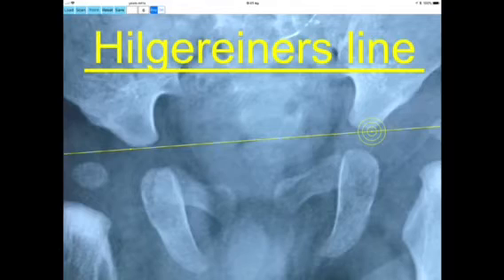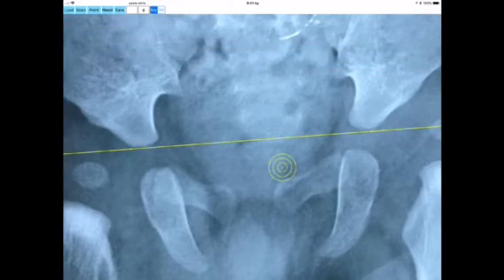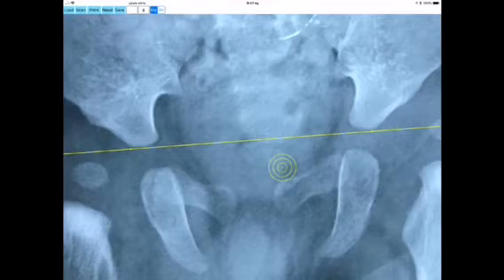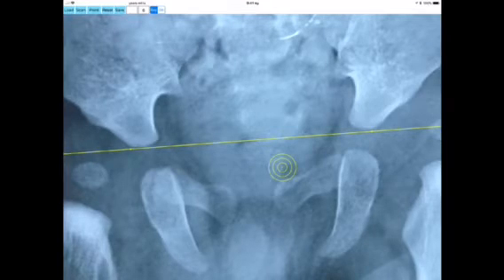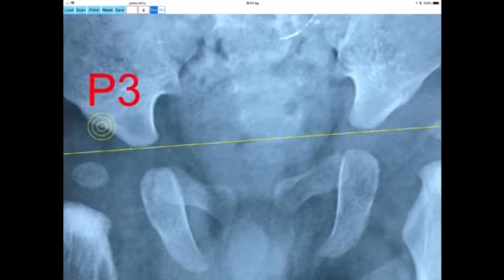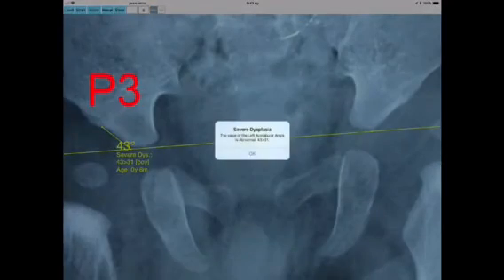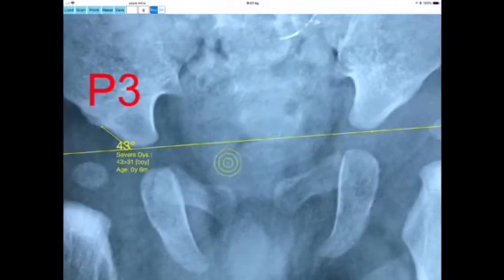Next you identify the third point, P3, at the lateral acetabular margin of the right hip, and by pressing the point button the third point P3 is marked. The angle formed between the Hilgenreiner's line and the segment P1-P3 is the acetabular index (AI) of the right hip, and the measured angle is printed near the right hip.